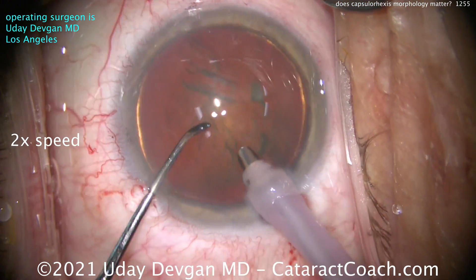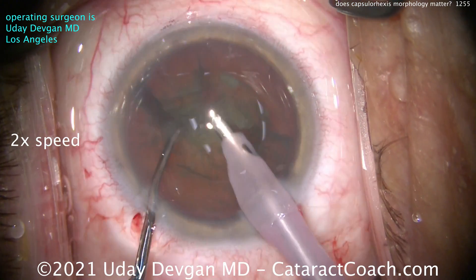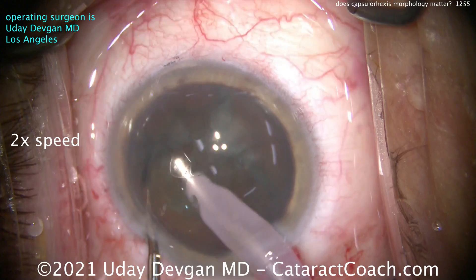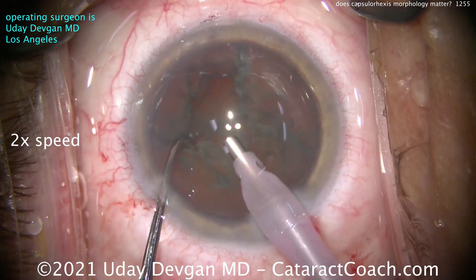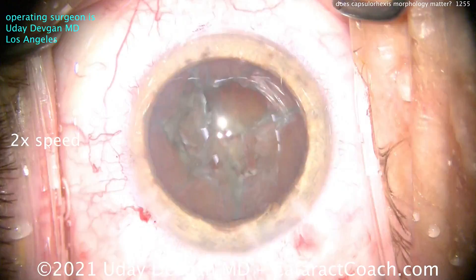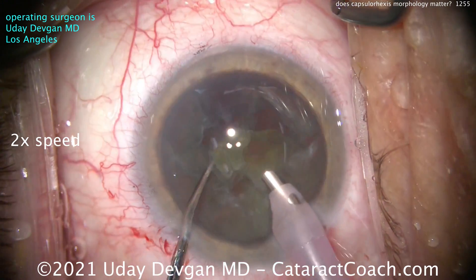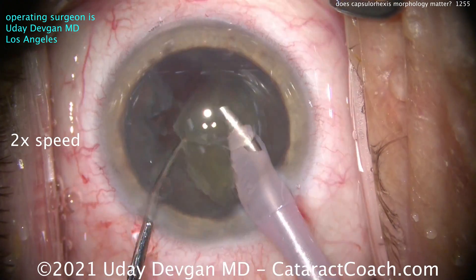Let me speed up the lens nucleus removal here. What's interesting in this case is it's kind of a softer, gummy cataract. I got a chop there, but I don't think it fully propagated, so we have a hard time pulling up the pieces. This is that type of cataract where it's not really dense and sometimes hard to get the chops to fully propagate. I've tried a couple of times in various quadrants and still not achieving what I want. I'm going to come out for a second, adjust the microscope settings, get a better view, and try something different — using the chopper to go behind those pieces and bring them up.